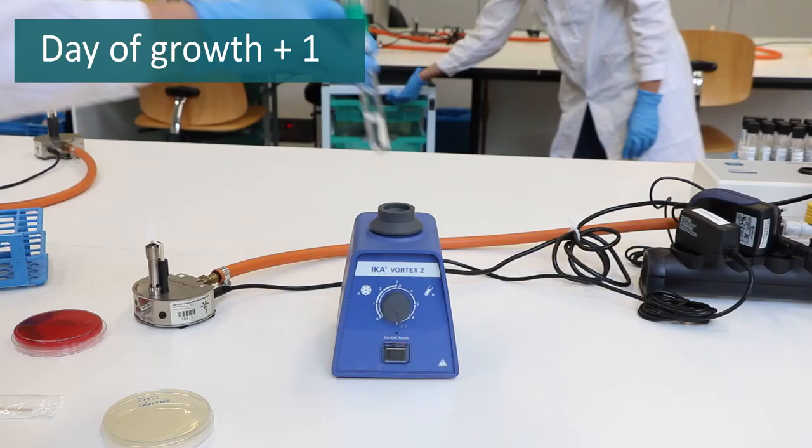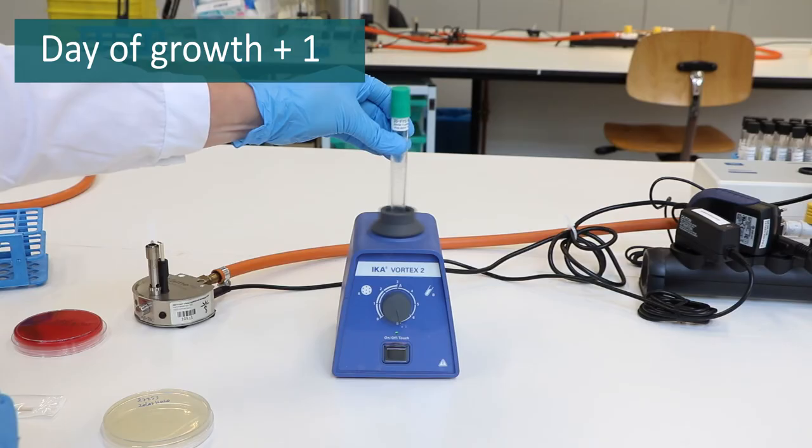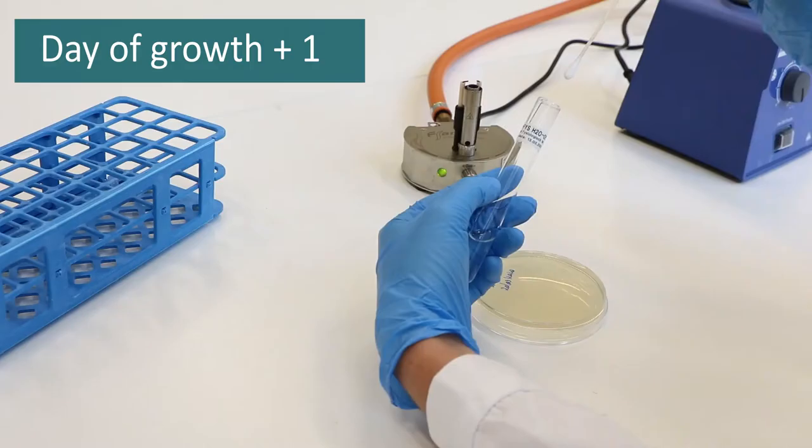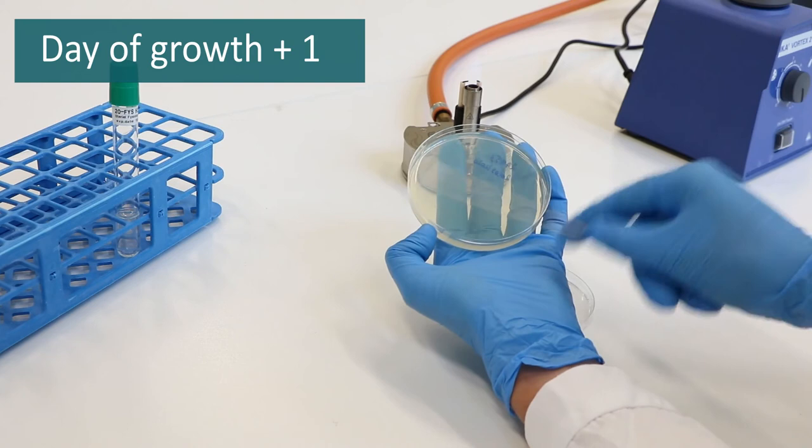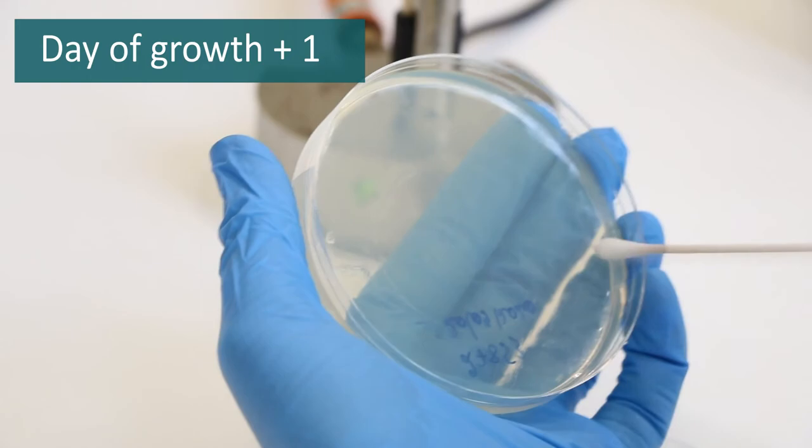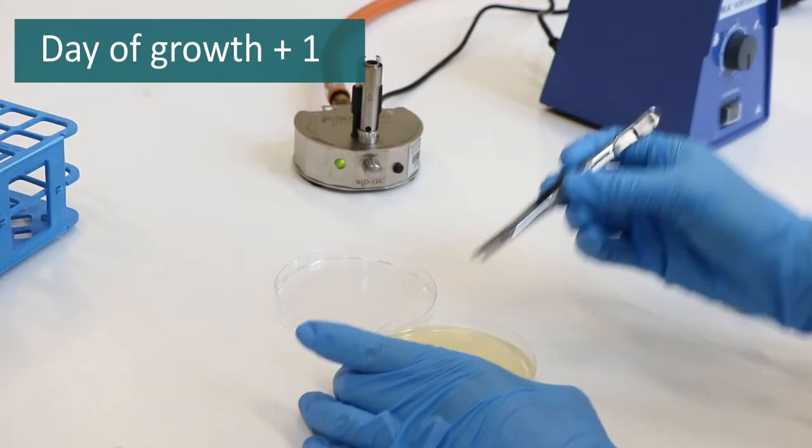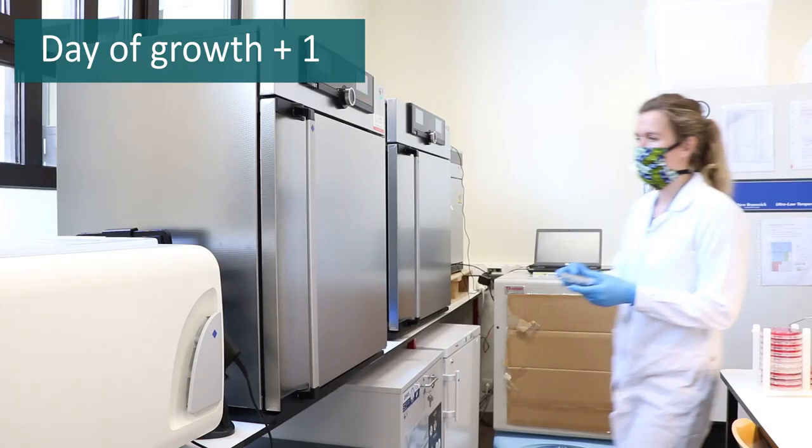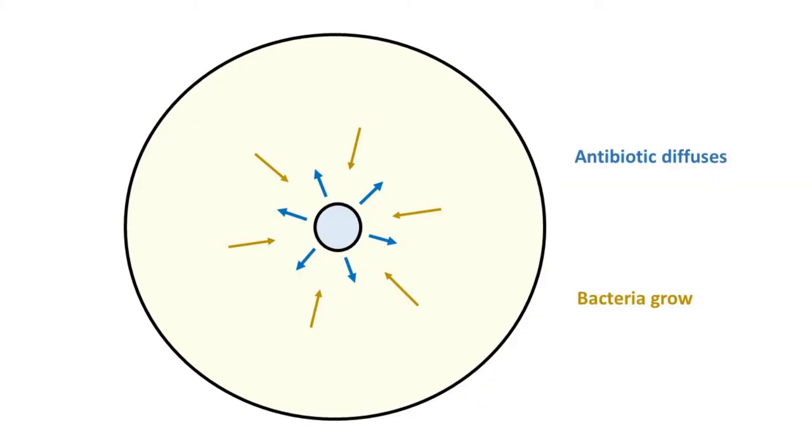For disc diffusion, a standardized bacterial suspension is spread on a specific solid culture medium. Antibiotic discs impregnated with a specific antibiotic are placed on top of the medium. The plates are incubated overnight. During overnight incubation, the antibiotic diffuses through the agar around the disc while the strain is also growing.